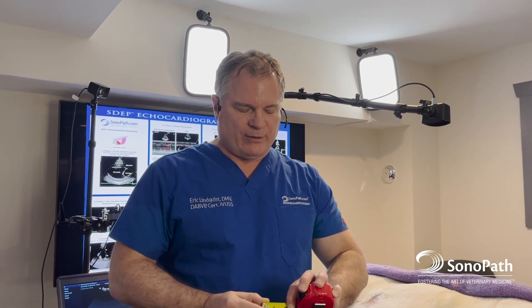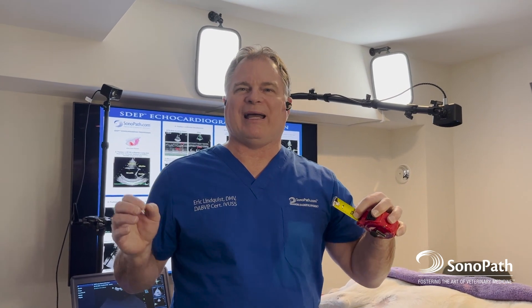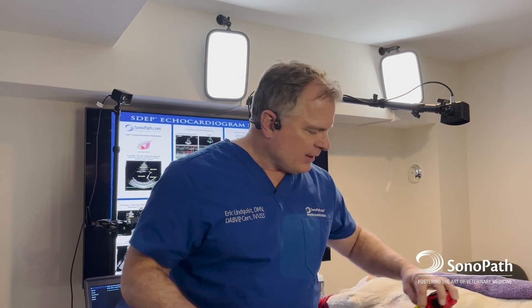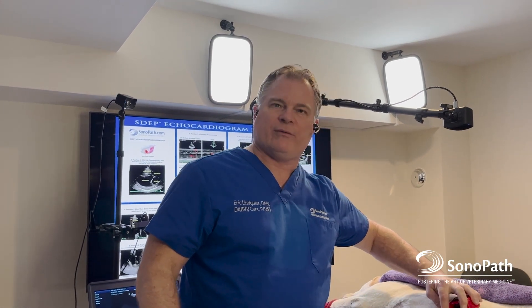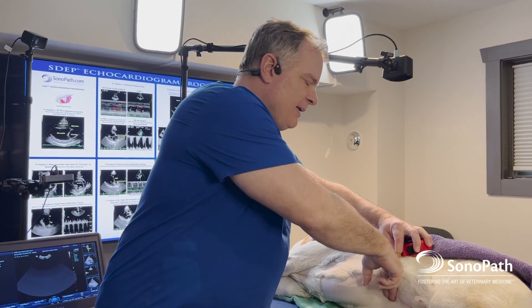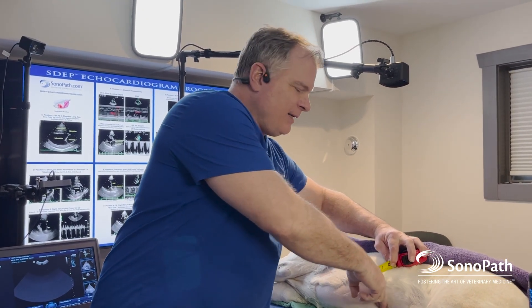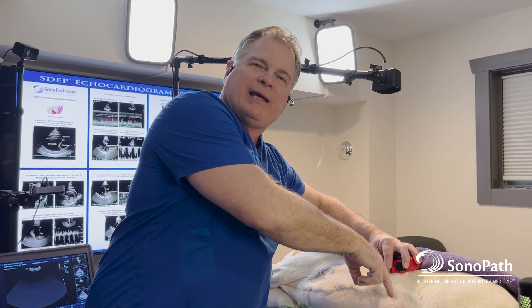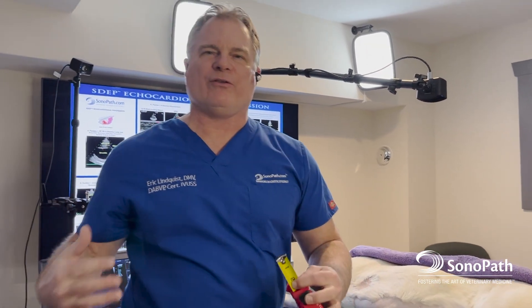Mid-level machines are 5-centimeter depth machines, meaning they have resolution that's diagnostic to 5 centimeters. The overall depth may go to 12 to 14 centimeters, but the best resolution is in the near field. So 2 inches — roughly 5 centimeters — gets you to about the kidney level, but you lose resolution when you push further. That's just physics — it's the acoustic power of the machine.